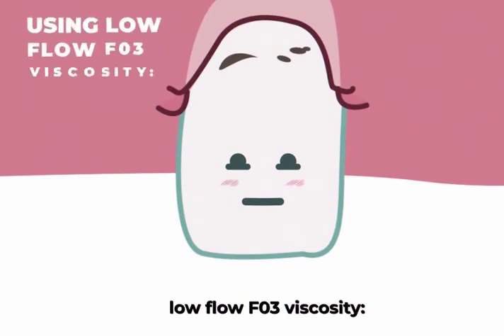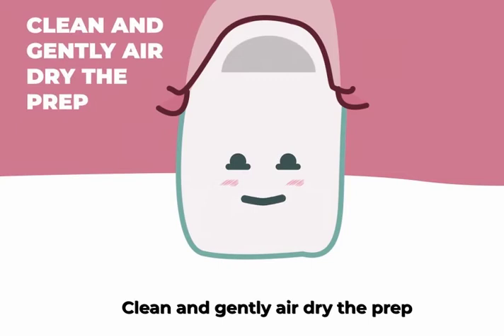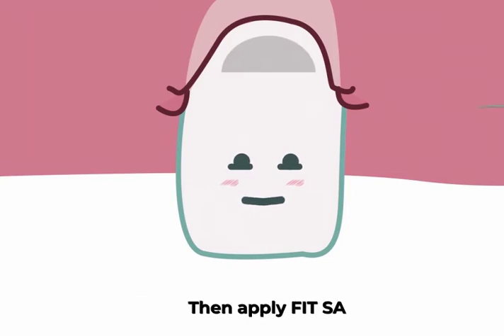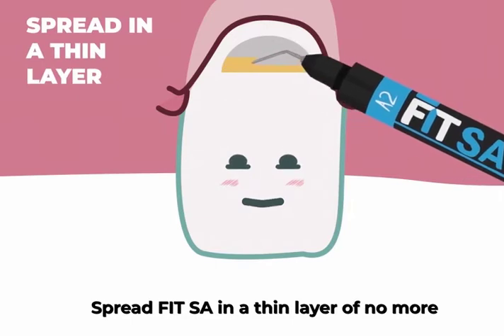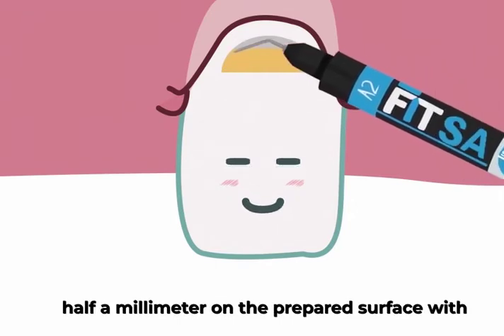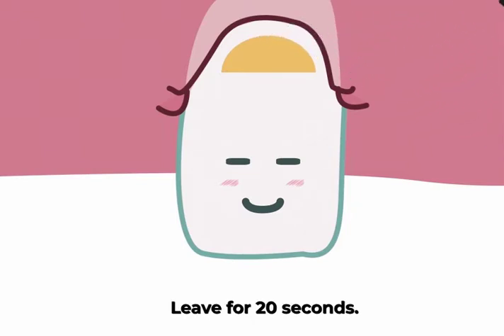For class 5 restorations using a low-flow F03 viscosity, clean and gently air dry the prep, leaving it slightly moist. Then apply FitSA. Spread FitSA in a thin layer of no more than half a millimeter on the prepared surface with a needle tip, a micro brush, or forced air. Leave for 20 seconds.